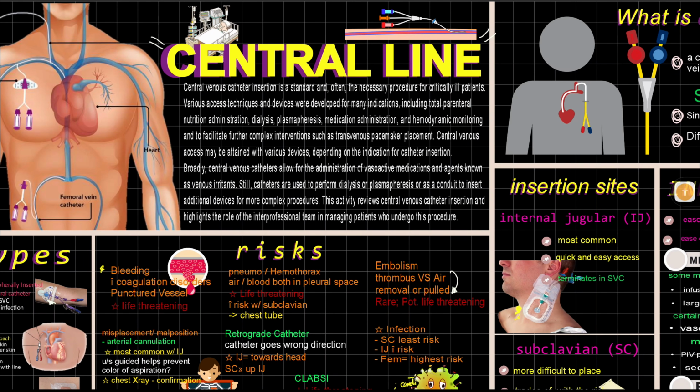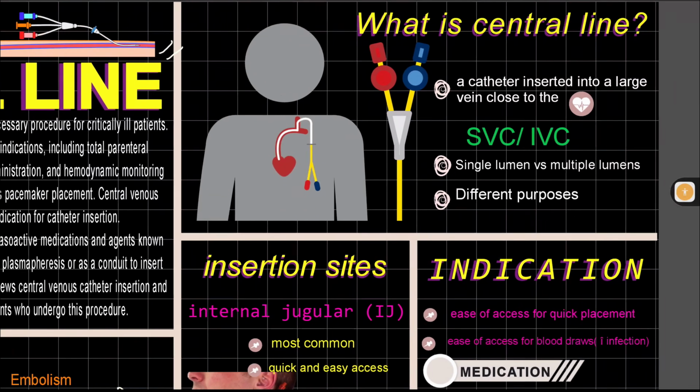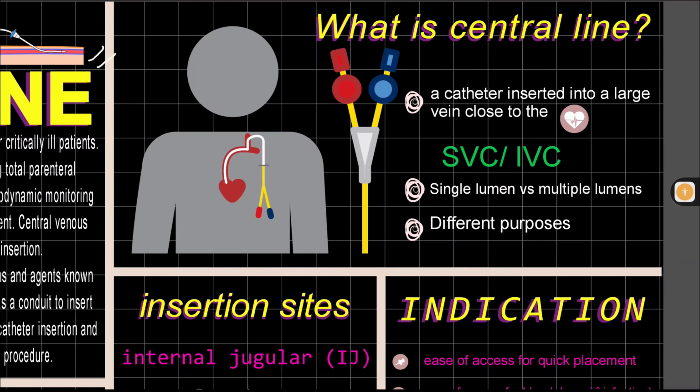Central lines are also used to perform dialysis or plasmapheresis, or as a conduit to insert additional devices for more complex procedures. In this activity that we're going to have today, we will review your knowledge when it comes to central line insertion and the central line procedure. All right, now that we have the overview of your central line, I'm going to proceed and discuss what a central line is.